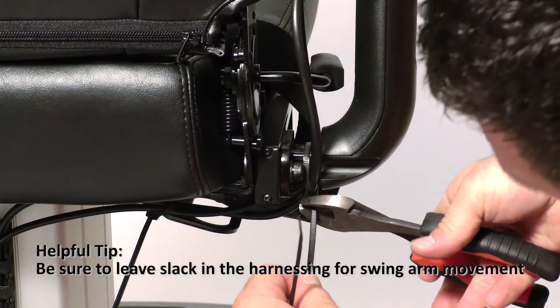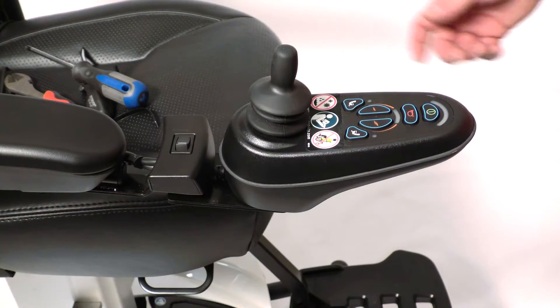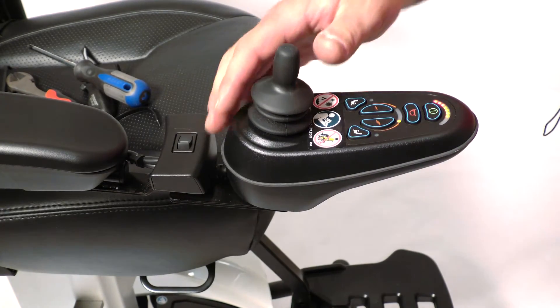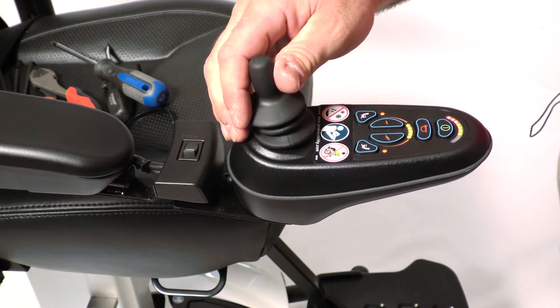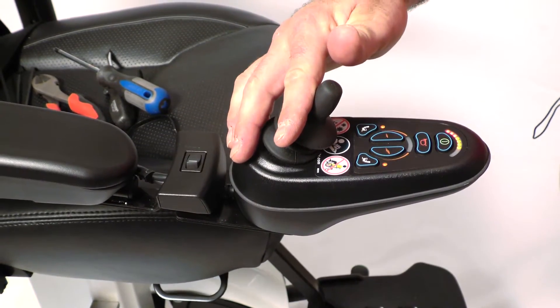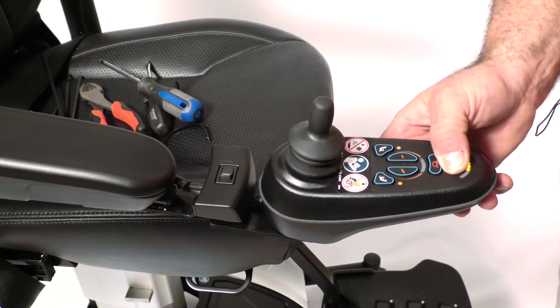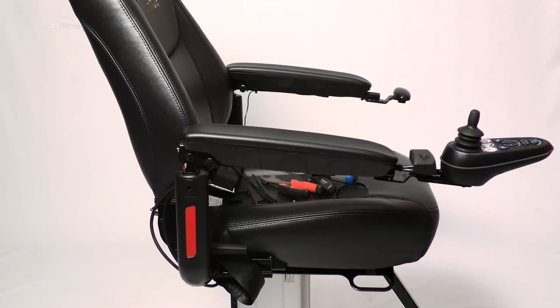Cut the excess flush. Turn the joystick on and make sure it powers up and all your functions work. And that is the replacement of the joystick on the Jazzy Air. Take care.